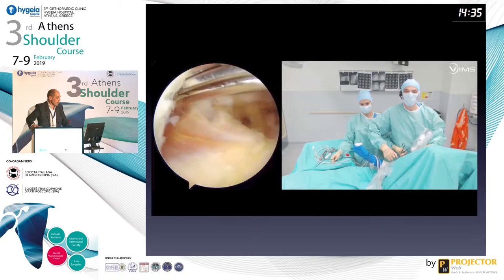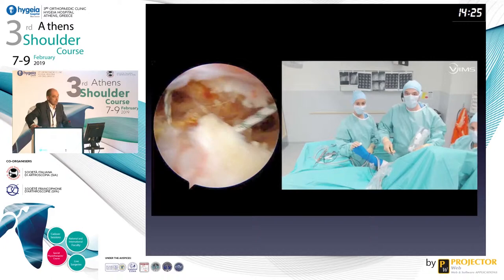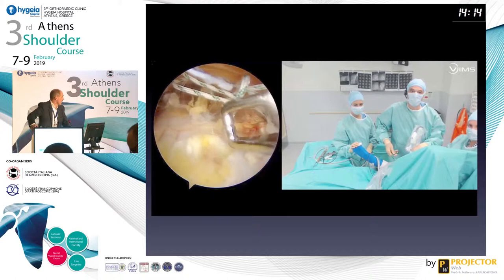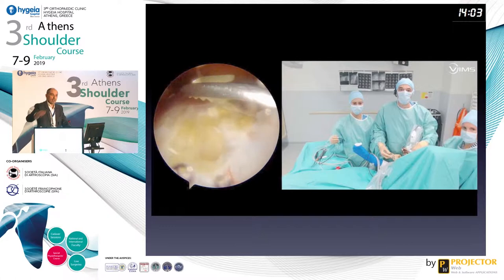So now this is probably the most demanding step, because you have to harvest it and be careful with the needle, as there is the radial nerve just up to that. I took time to understand how to harvest it, and as I show you now, I make a triple Krakow suture. And why is it difficult? Because the direction is never perfect, but it's made easier after tenotomy of the pec major.